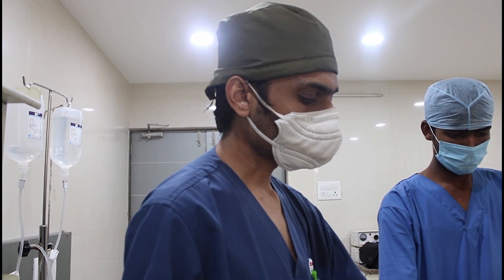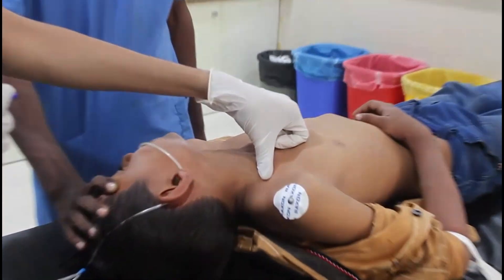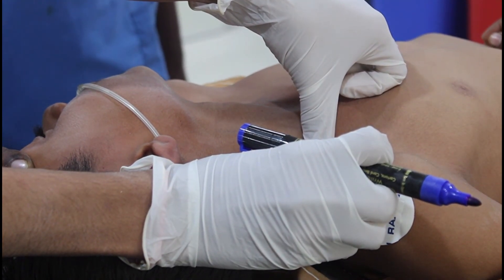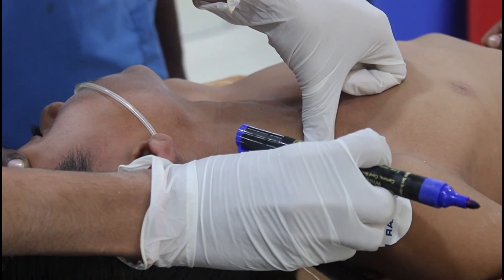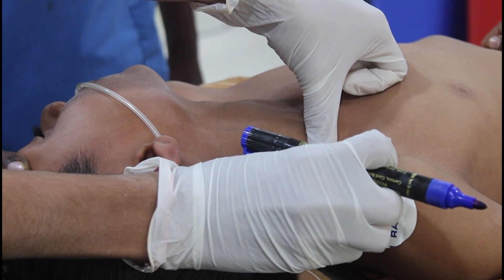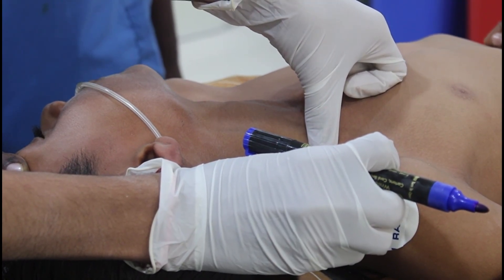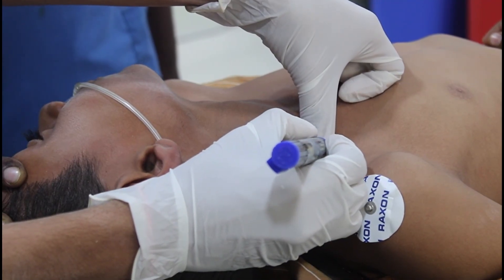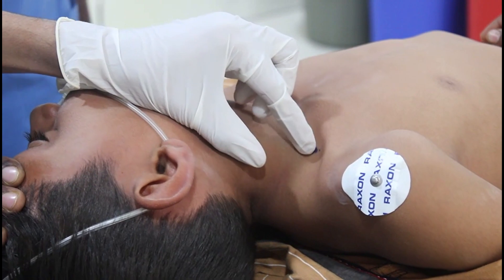Before giving the block, I will draw the landmark for the supraclavicular block. You have to try to palpate the subclavian artery just above the clavicle. By your thumb you can palpate the subclavian artery. I can nicely get the pulsation of the subclavian artery. The pulsation of the subclavian artery is nicely felt above the clavicle. This is my subclavian artery and my entry point will be just posterior and lateral to the pulsation of the subclavian artery.